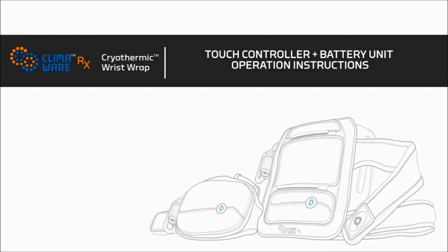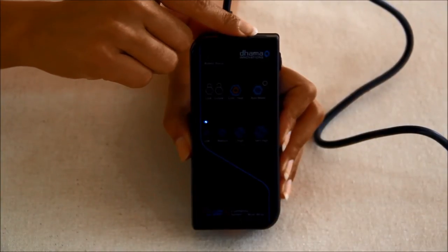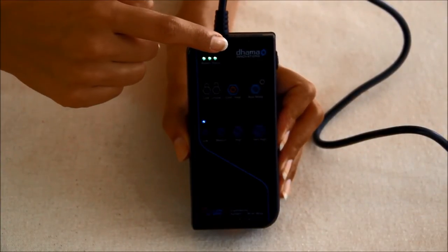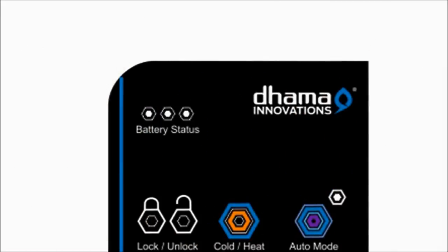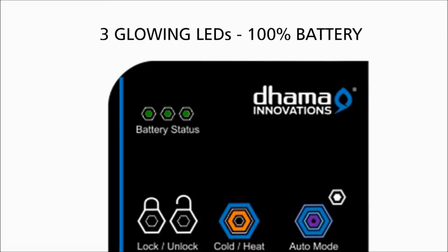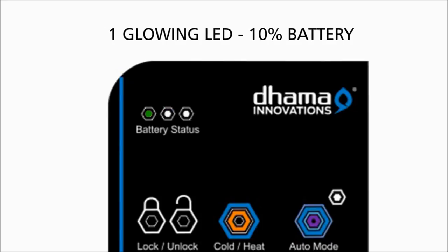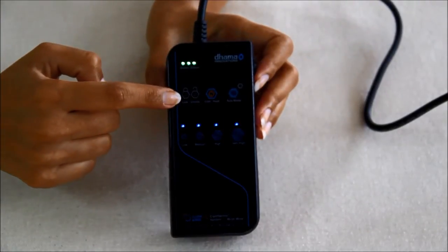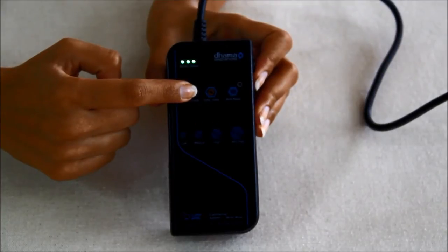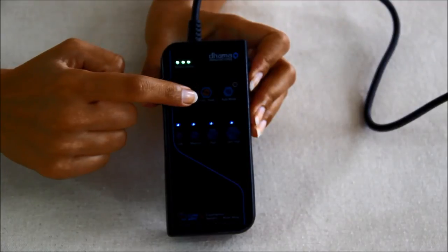Now let us discuss how to operate the touch controller and battery unit. Battery status: as soon as the unit is switched on, the green LEDs indicating battery status will start to glow and will stop glowing when the battery runs out and needs to be recharged. Three glowing LEDs indicate 100% battery, two glowing LEDs indicate 50% battery, and one glowing LED indicates 10% battery. Lock/unlock button: this is a toggle button — press and hold once to lock the system, deactivating all controls. Press and hold again to unlock the system.